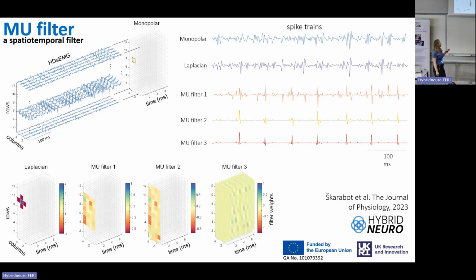If, instead of 21 channels, we select 58 channels, or 28 and 51, I think, we get a better spike train, which is still a bit noisy, but much better in accuracy. At this point, we've used all the spatial coefficients of the motor unit filter.